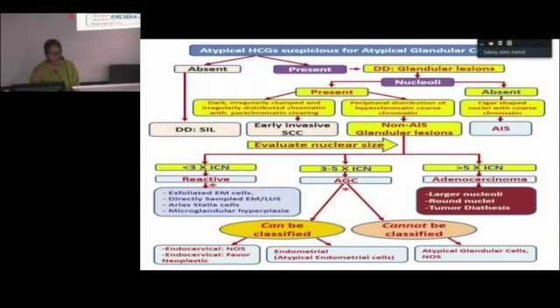It can be because of exfoliated endometrial cells, directly sampled endometrium, Arias-Stella reaction, microglandular hyperplasia, and several others. If the size of the nucleus is 3 to 5 times the size of an intermediate cell nucleus, only then can you call it, on cytology, atypical glandular cells.